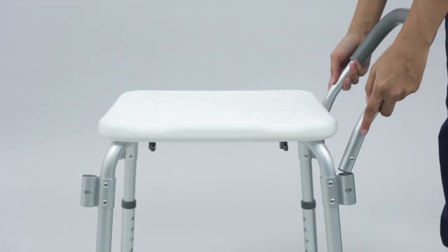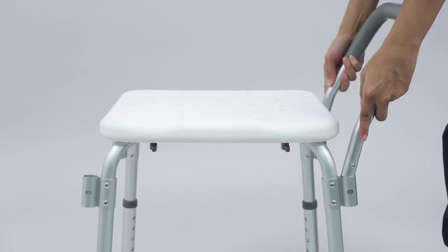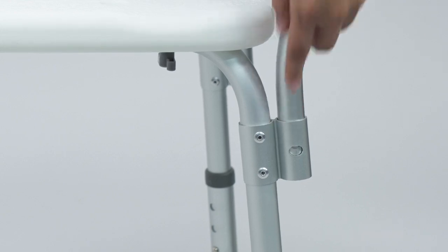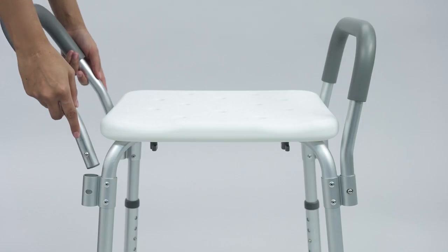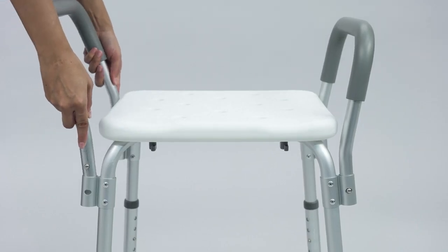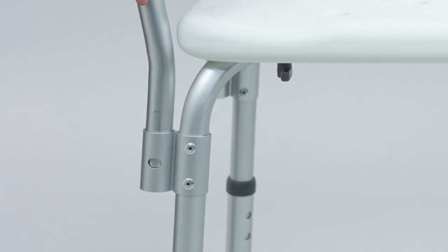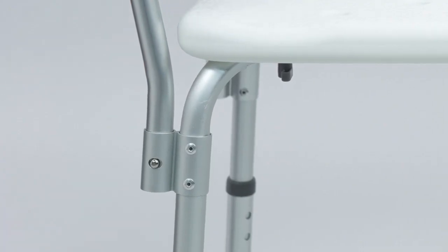Insert an armrest on each side of the seat bench. Ensure the curved bar of the armrest extends outward from the bench. Depress the push button and check that the push button protrudes fully.